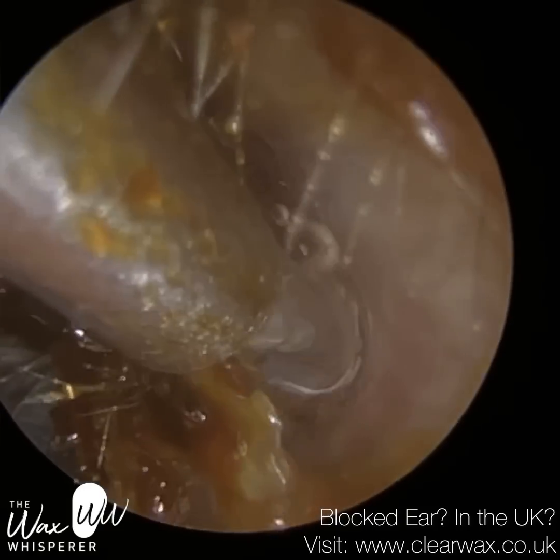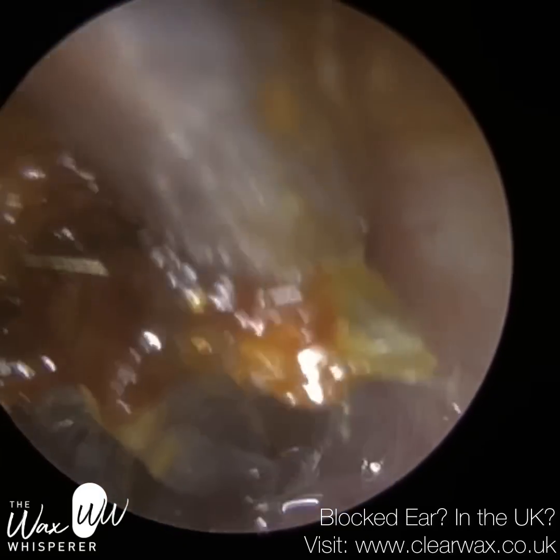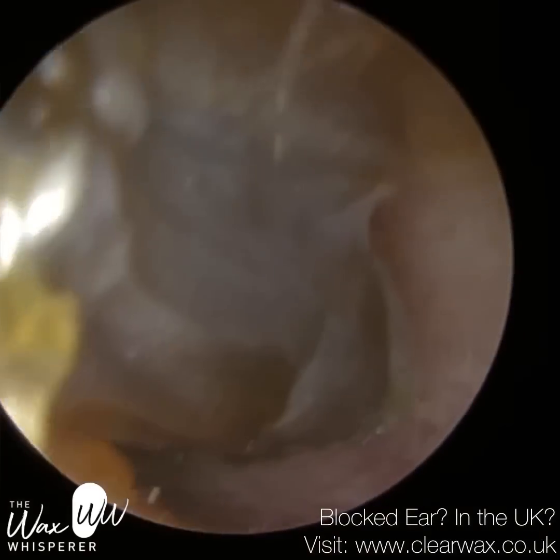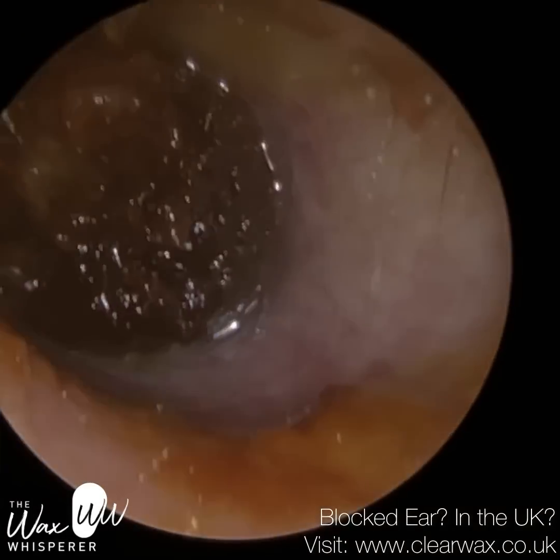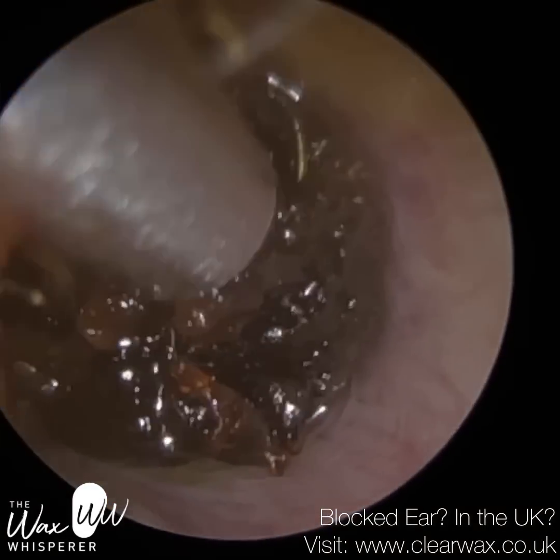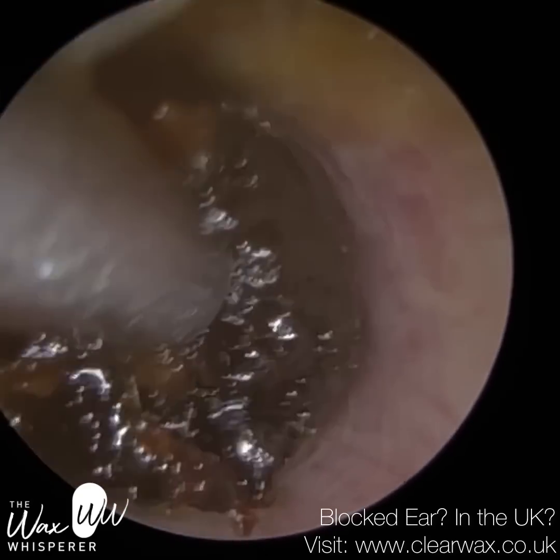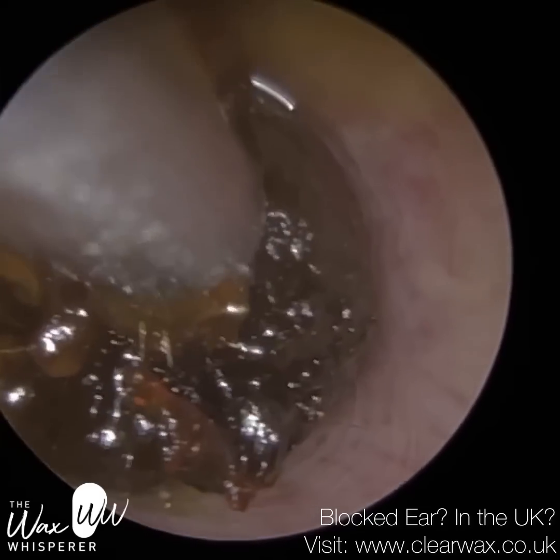Now, I've just put some oil in myself just to help further bind this wax. Sometimes if a patient overuses drops prior to their appointment, the wax becomes very loose and wet, and I preferably want to remove this in large pieces just like that. Olive oil during the procedure itself has this binding effect. It almost acts as an egg in a cake, fish cake or potato cake recipe. It's like the glue, it binds it together.